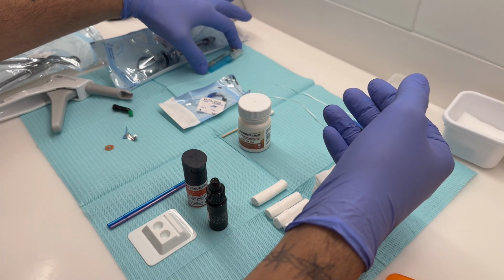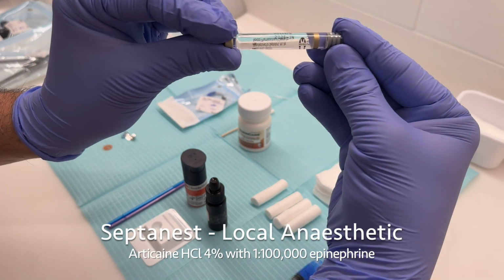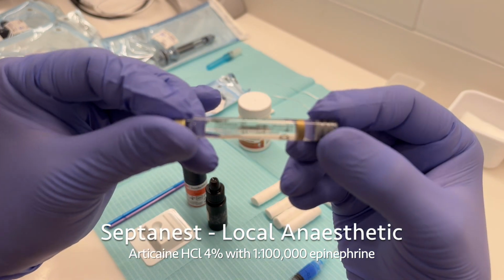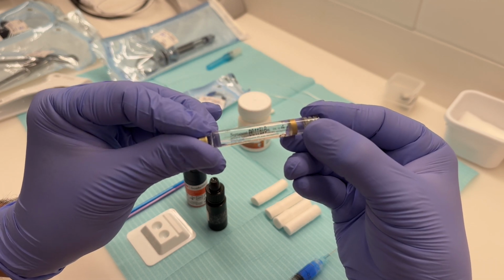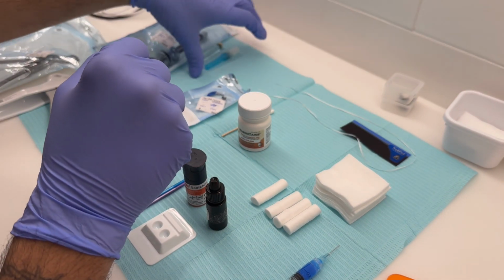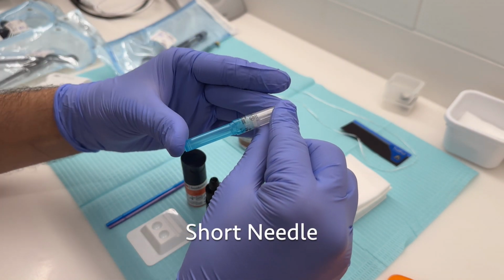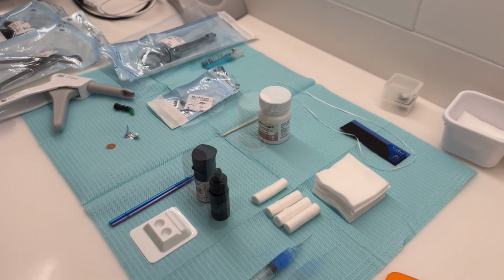Our choice of local anesthetic today is Septanest. We use Septanest sometimes when the doctor wants a quick onset of anesthesia, and sometimes if a patient is resistant to typical lidocaine as noted in their chart. Since we're going to be doing an infiltration for the 4,5-DO that our doctor is going to be doing a restoration on, we'll be using a short needle.